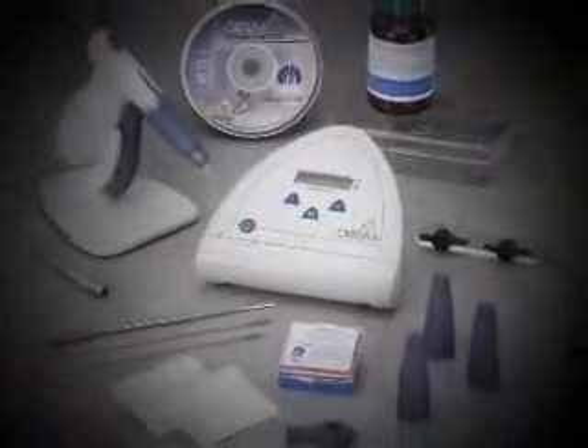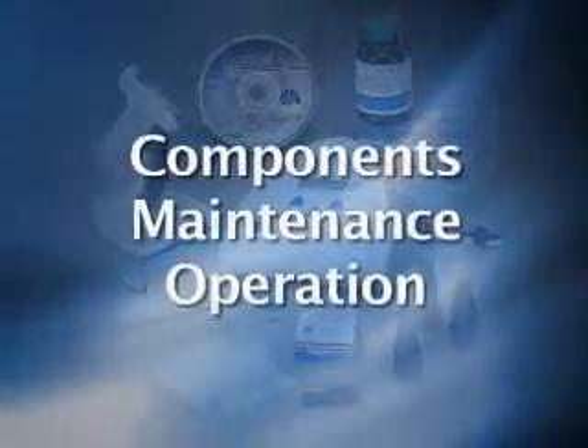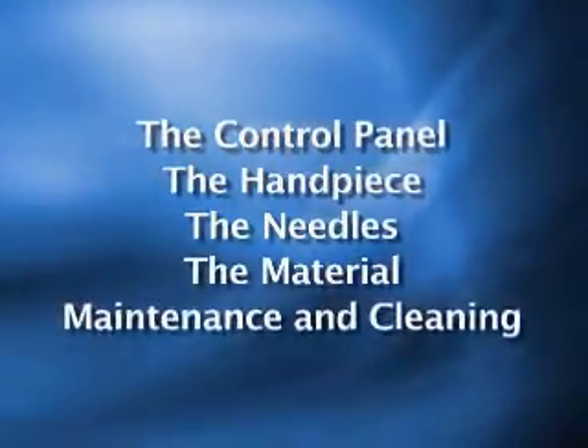The first step in achieving optimum proficiency is becoming familiar with the Aptura system's components, maintenance, and operation. This orientation DVD covers five key sections: the control panel source, the handpiece, the needles, the obturation material, and maintenance and cleaning.